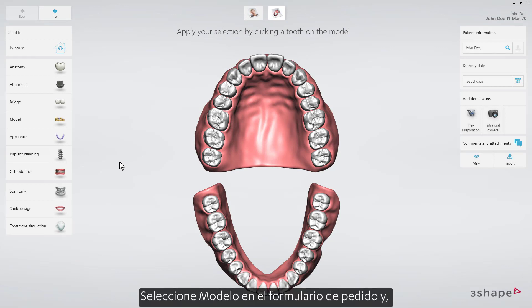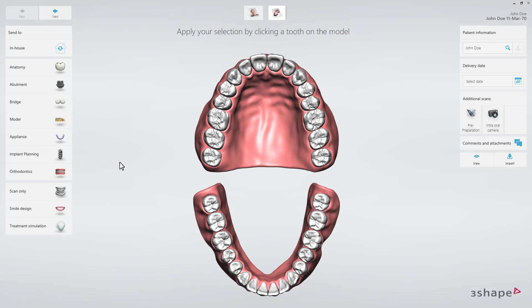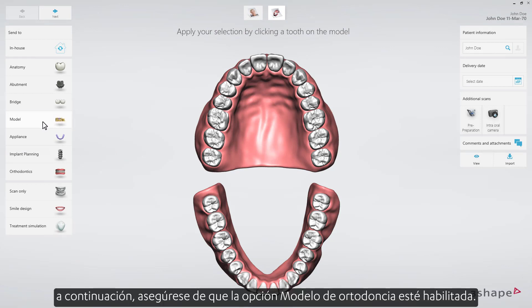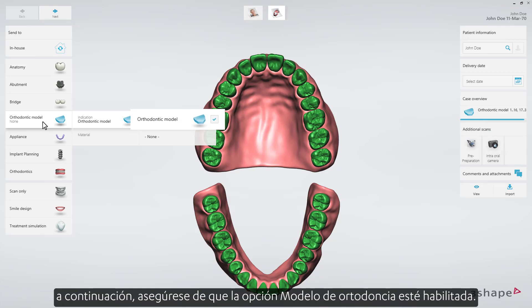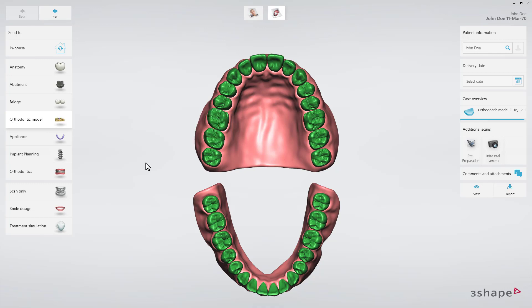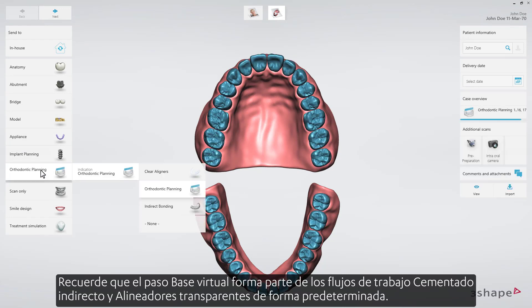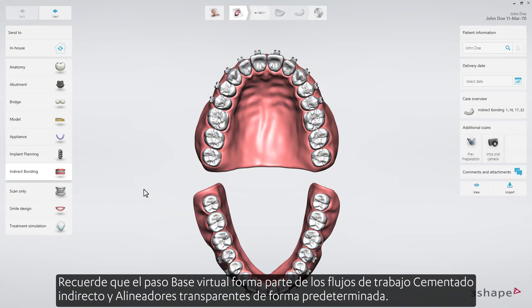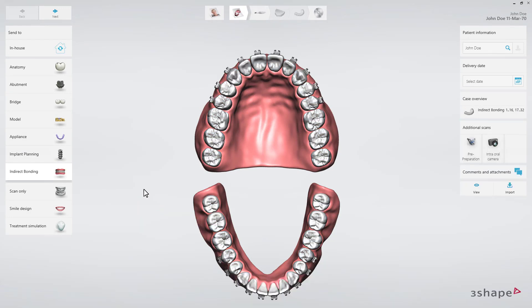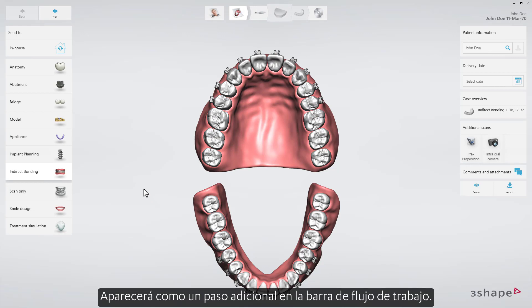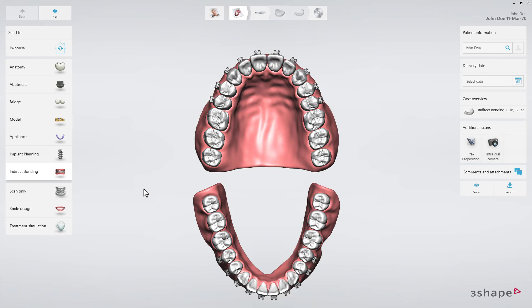Select Model in the order form, and then make sure the Orthodontic Model option is enabled. Please remember the virtual base step is part of the Indirect Bonding and Clear Aligners workflows by default — it will appear as an additional step in the workflow bar.